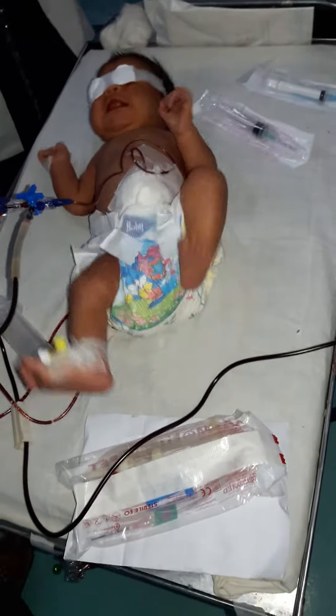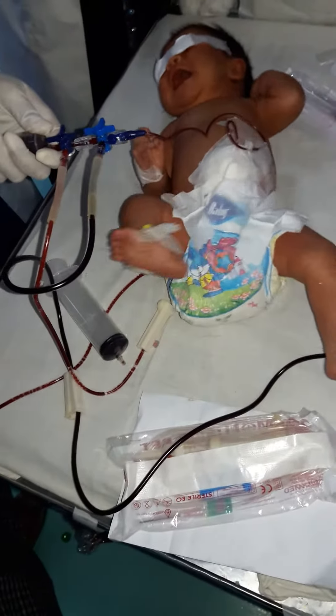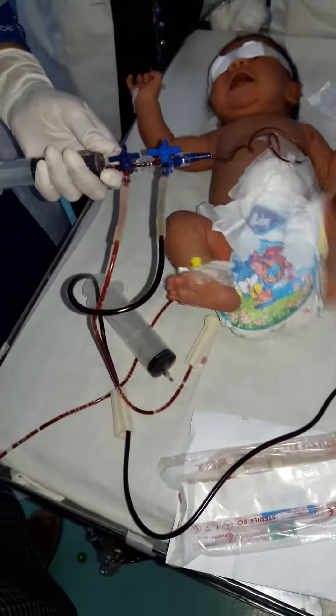I think I have to show you how to do it. This gives me a chance to come into this thing. Instead of this thing — no. I said you are going to take it. That's right. You see how to do it now.